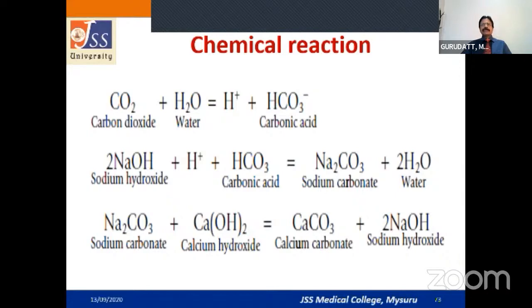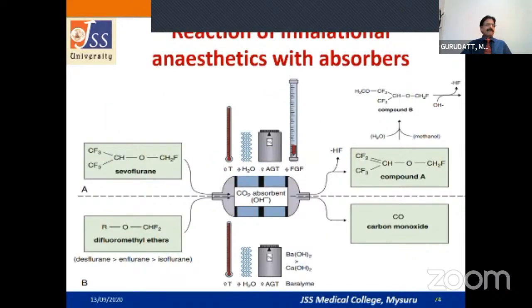But I was talking to you about the reaction of these inhalation anesthetics with the absorbents. So how do they react? When do they react? Again, this is a very important question for your exams. When you're using sevoflurane, whenever the temperature is very high, because as you continue to use the soda lime a lot of heat is generated; second, when the soda lime gets desiccated and becomes dry; and third, when you are using a higher volume or higher concentration of the inhalation agent; plus, if you are going for a very low fresh gas flow, that is, very low flow anesthesia.